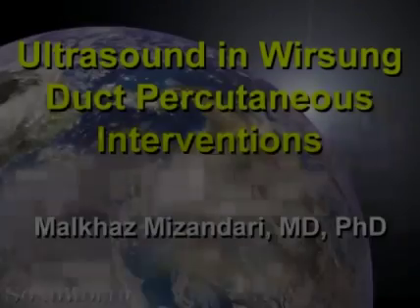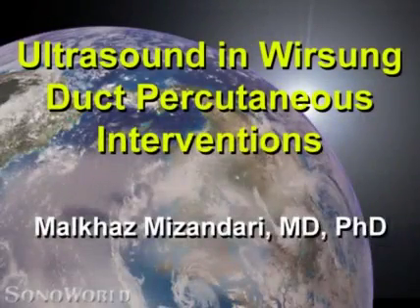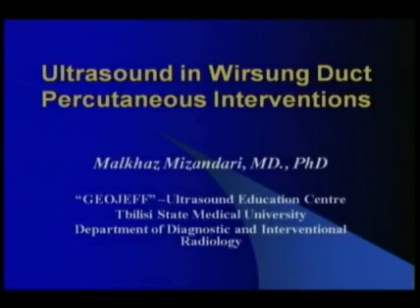Today we'll have a talk about the Wirsung duct interventions which we perform under ultrasound guidance. So, ultrasound in Wirsung duct percutaneous interventions.